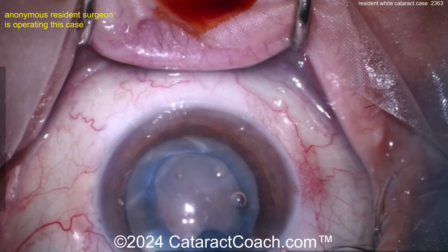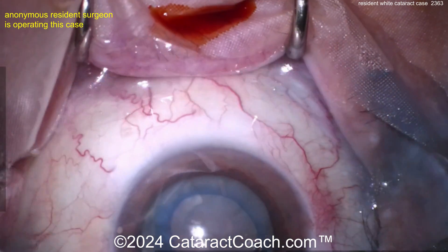Rexis is done and now it's time for nucleus removal. Let's see the technique here.